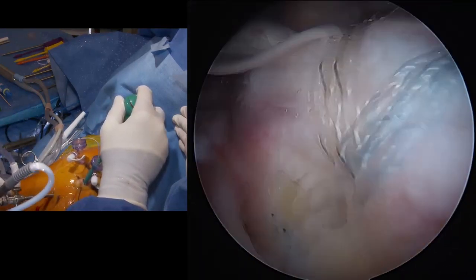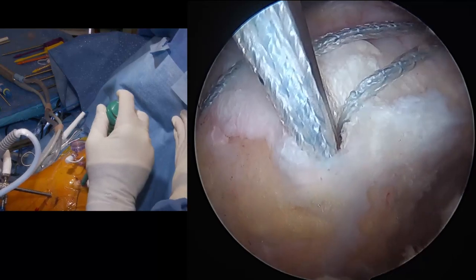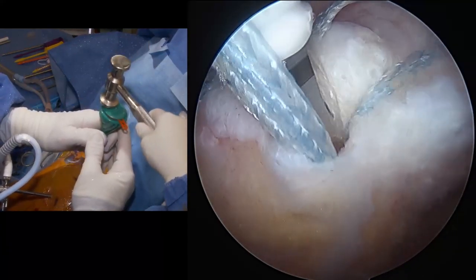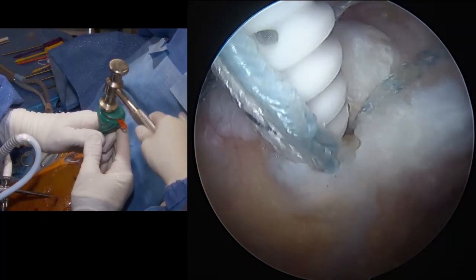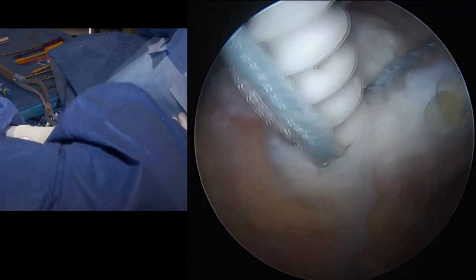How's that look? We got the blue there. We got the white over the top. That looks pretty good. Okay, go ahead and tap that in. No more, good. Find the open-ended cutter.